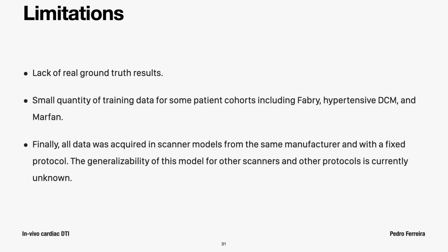In terms of limitations, in this work we have a lack of real ground truth results. We have a small quantity of training data for some patient cohorts, including Fabry, hypertensive, DCM and Marfan. And finally, all data was acquired in scanner models from the same manufacturer and with a fixed protocol. The generalizability of this model to other scanners and other protocols is currently unknown.